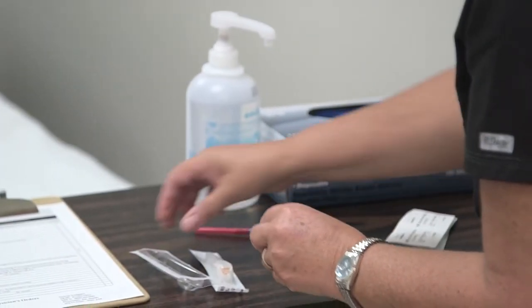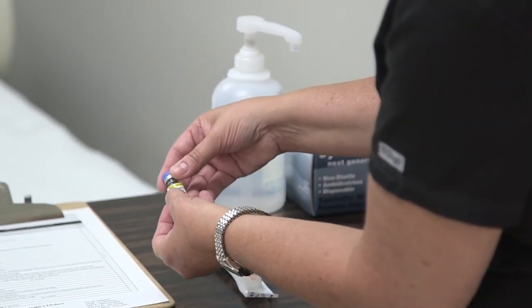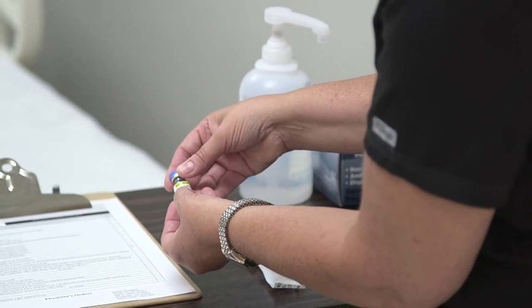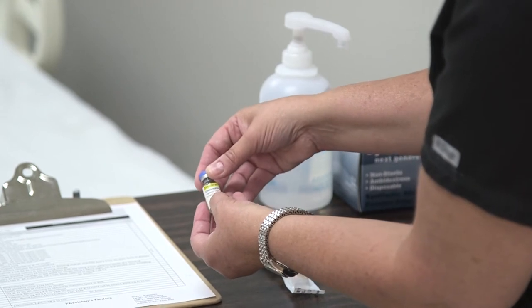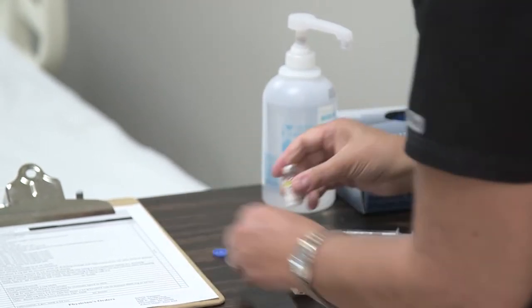Okay, so then next I'm going to go ahead and prepare my dose of medication. So again, I'm just going to double check, make sure I have the right medication and I'm giving the patient the right amount. So I'm going to give this patient 4 mg, and that is in a concentration of 2 ml. So we're going to go ahead and open that up.